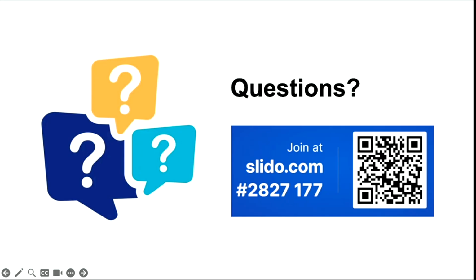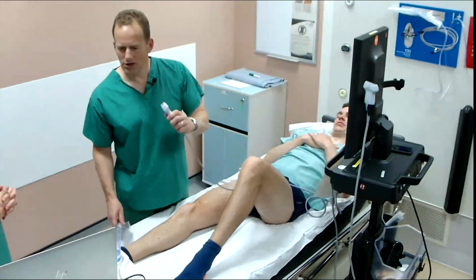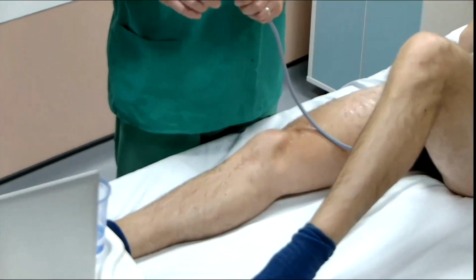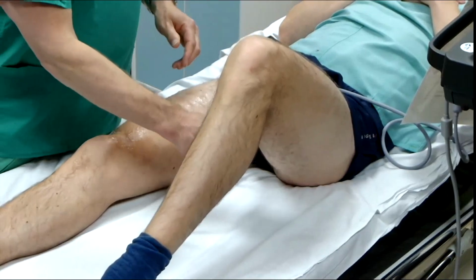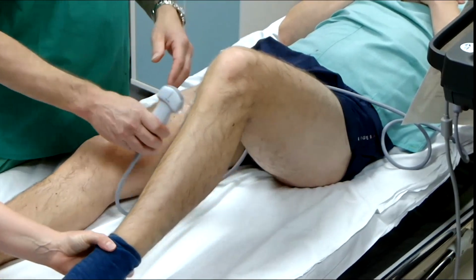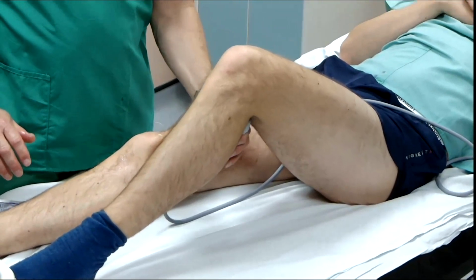So I think Max's knee obscured the probe position you made for the iPACK block. Is there any chance you can show people on Max's left leg? Yep, sure. Assuming it was the iPACK block. Yeah, so it's really the same as if, maybe if Max moved it there. It's quite hard when it's quite a small room.